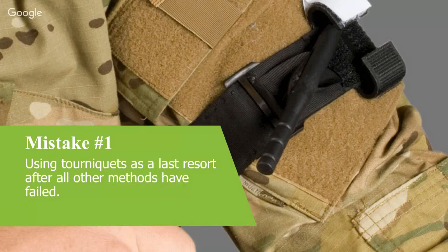Yeah, definitely. I mean, studies have shown they are very safe for up to that 2 hour period, which I'm sure we're going to talk about a little bit later on. So a big one from this one is, we don't want you waiting till the patient's in shock to apply these tourniquets. We know the outcomes not very good.